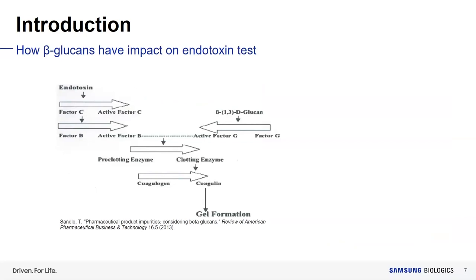Beta-glucans can result in a false positive reaction in endotoxin testing because the final reactions of the endotoxin and beta-glucan signaling pathways in LAL are the same. Although false positive reactions do not impact patient safety or change the regulatory perspective, they could financially impact manufacturers through quality record investigations and product rejections, and may also impact drug supply. Therefore, false positive reactions should be prevented.